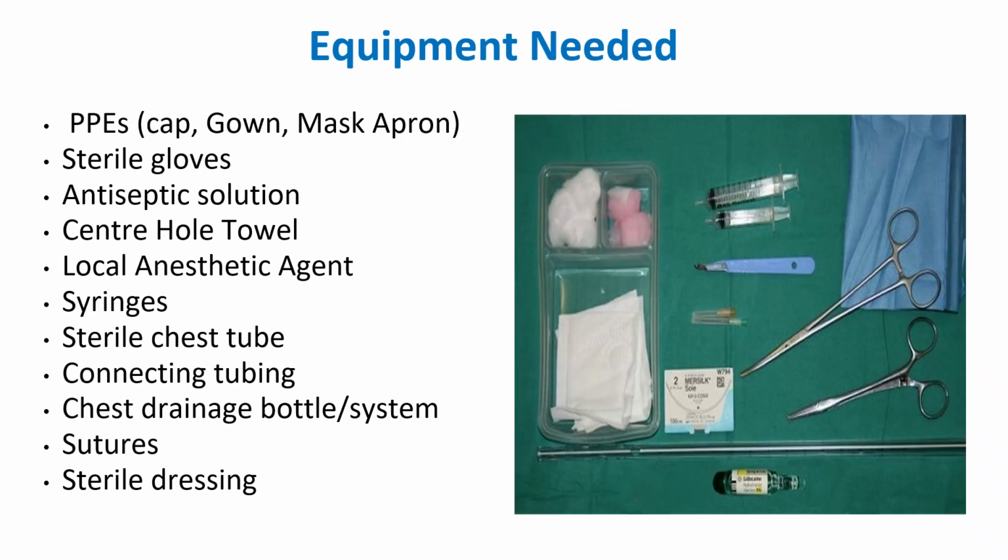Okay. So what equipment is needed? What are all the articles needed to perform the ICD procedure? When you are collecting the articles, if you remember the procedure, you will never forget to take the articles. You will never miss out things.